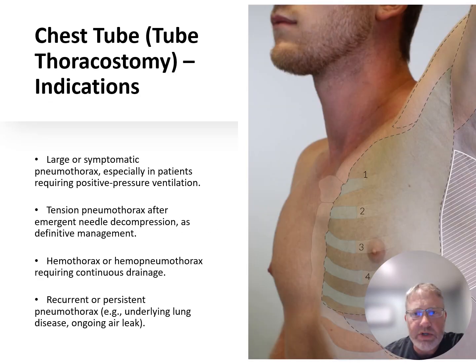Switching gears to chest tubes, they are and have always been the definitive management for most clinically significant pneumothoraces and many hemothoraces, blood in the space.